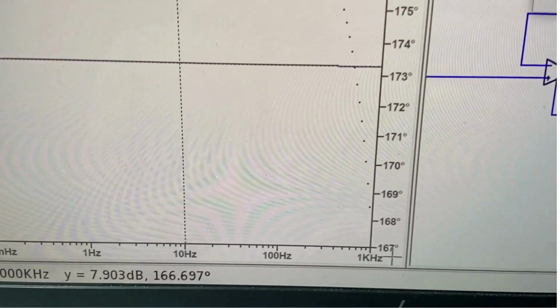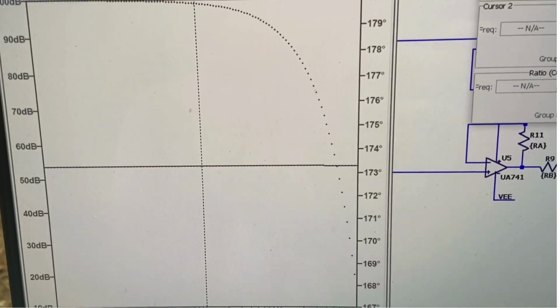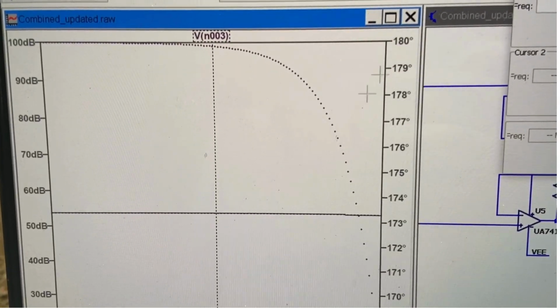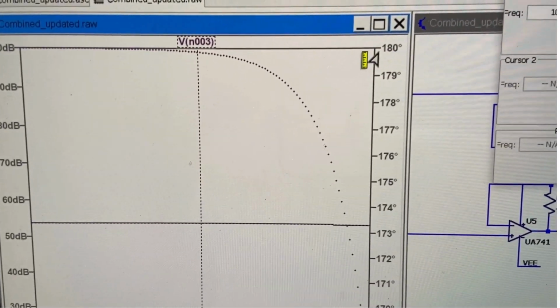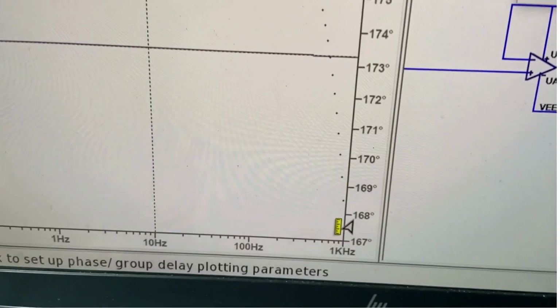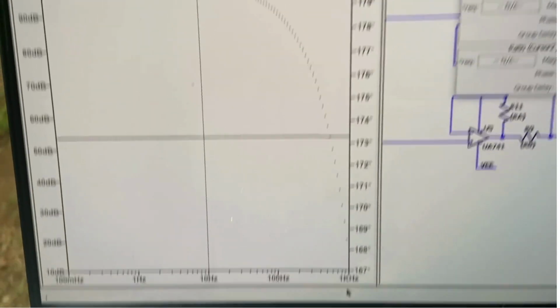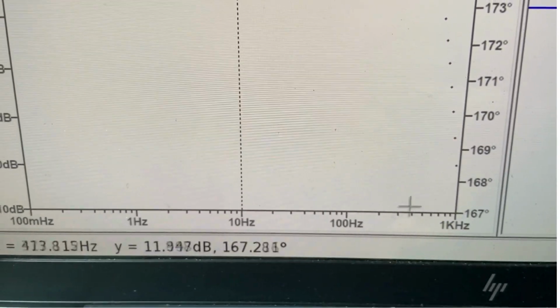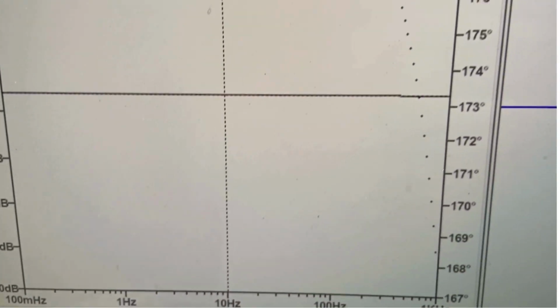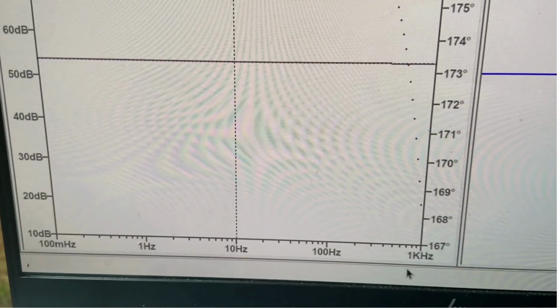The instrumentation amplifier essentially makes sure that there's a phase difference of 180 degrees, and we are seeing that the difference is not very large, from 180 degrees to 167 degrees. Moreover, it's not a point of contention in our case because this happens only at very large frequencies of around 1 kilohertz, and we are operating at much lower frequencies.